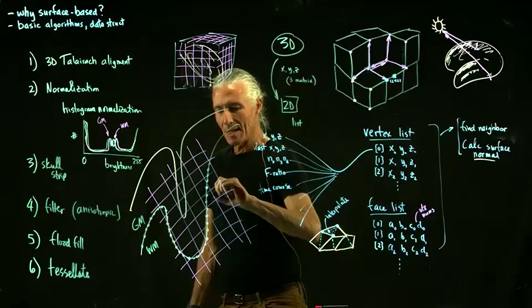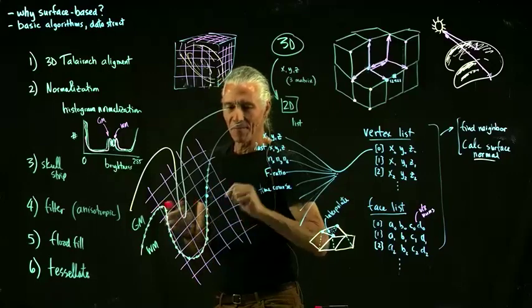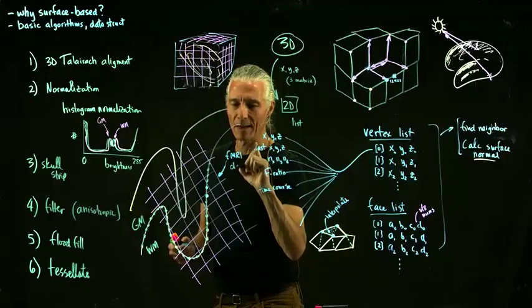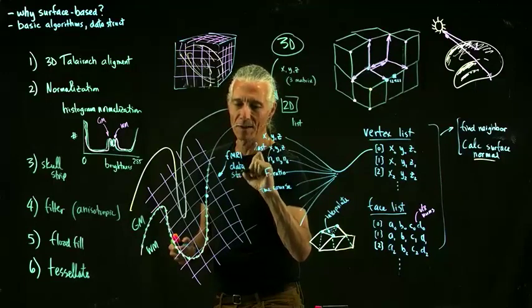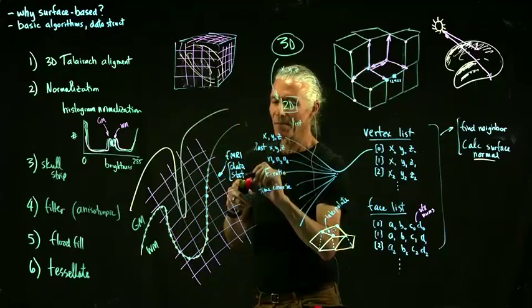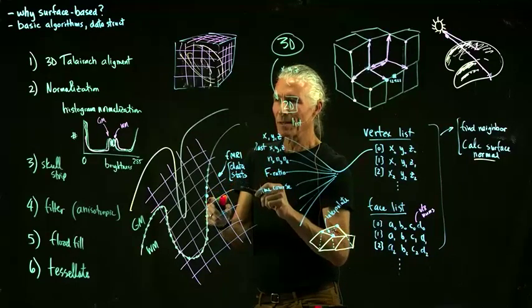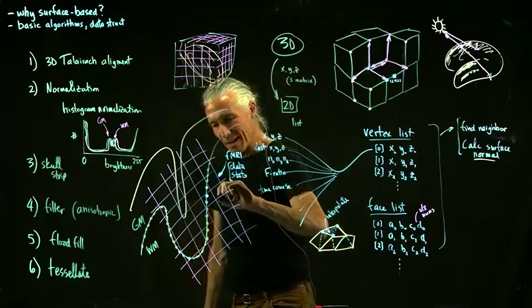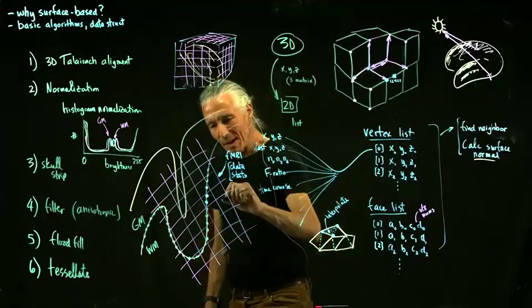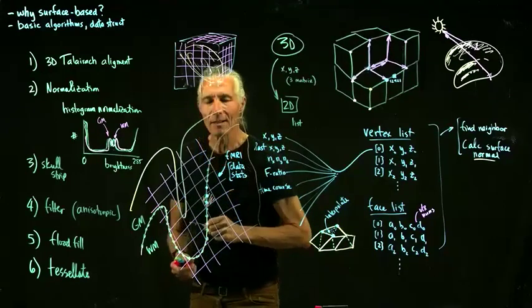So one thing we could say is maybe the data at that vertex is whatever voxel it's inside. So this is fMRI data and stats. So we might have had a time course, and then we calculated an F ratio out of the time course, and we have one of those time courses and stats at each voxel here. But what are we going to say? What does this vertex actually get? So we could just say, well, maybe it gets the one that it's inside, but in that case, it's going to be kind of close to the gray-white matter border.